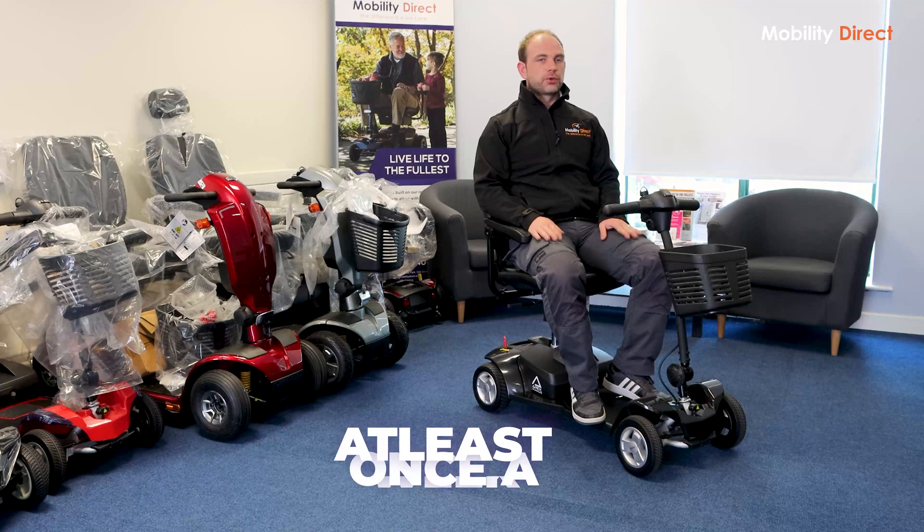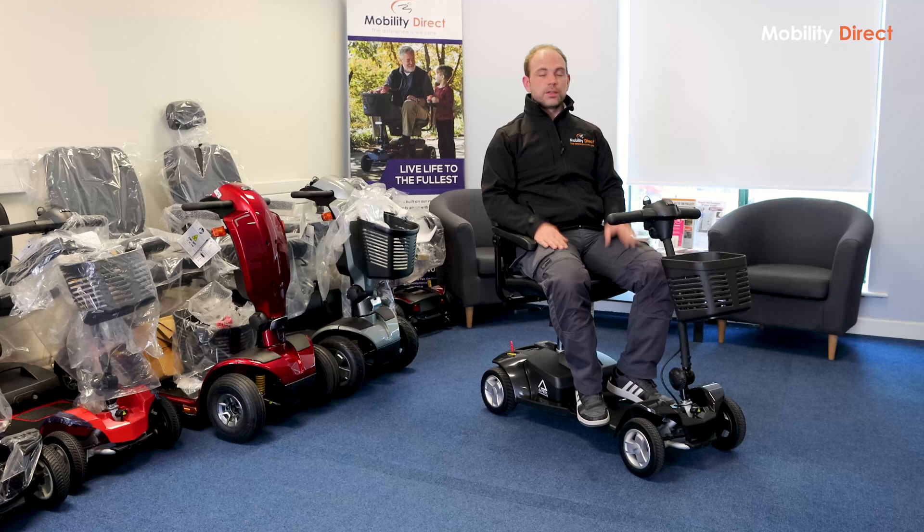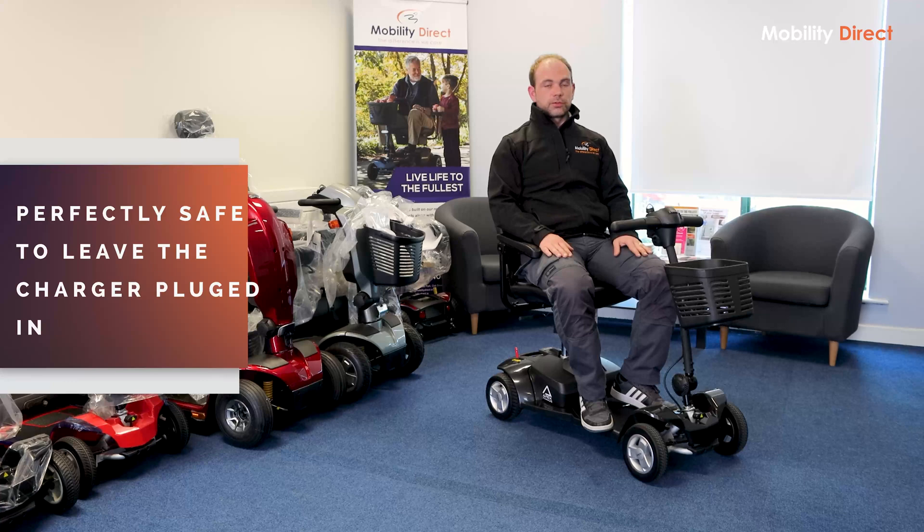When it comes to charging, we recommend charging the scooter at least once a week. If you are using the scooter on a daily basis, we'd recommend charging every day or every second day. Usually what we recommend is charging overnight — that's usually the easiest way to go about it. Typically it takes about eight hours to recharge the batteries, so doing this overnight is the easiest and handiest way.